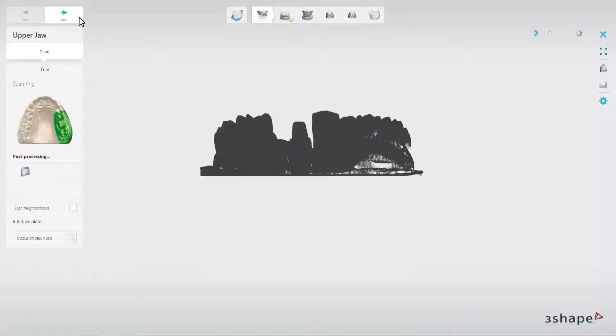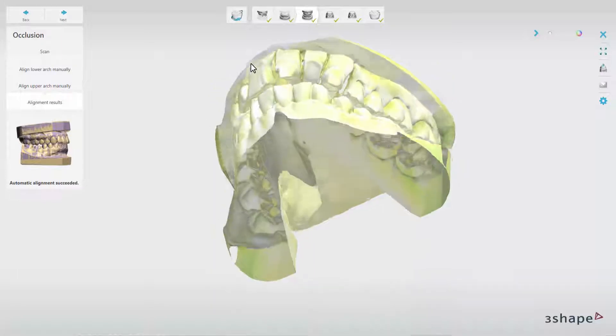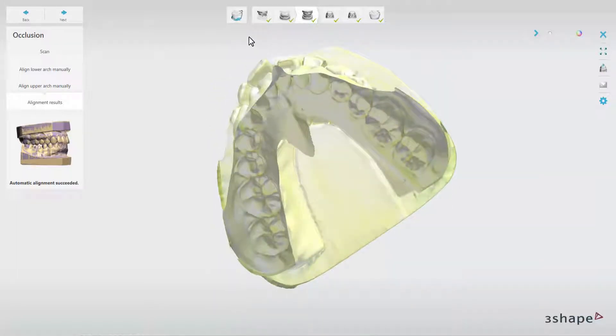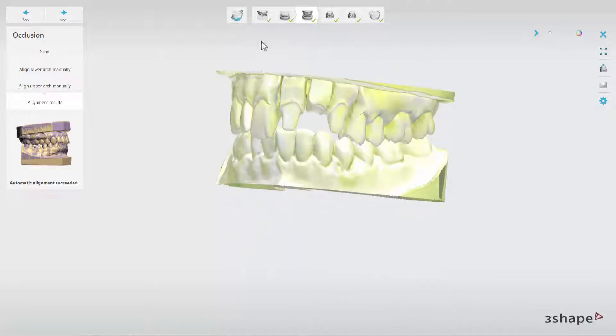Then the lower model will be scanned. When scanning has finished, the software automatically aligns the bite thanks to the earlier calibration of interface plates. At that stage, you can also check individual scans by switching between them.